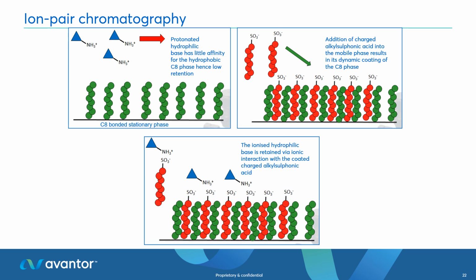We can also see the converse of this, where the ionizable molecule itself interacts with the oxygen. So quite a complex series of interactions occurring that are very, very dynamic. So equilibration becomes very, very important with this type of technique.